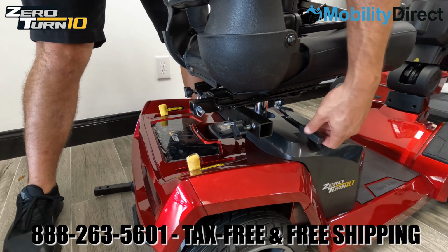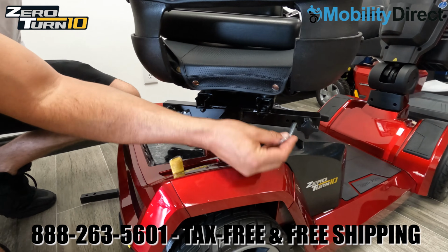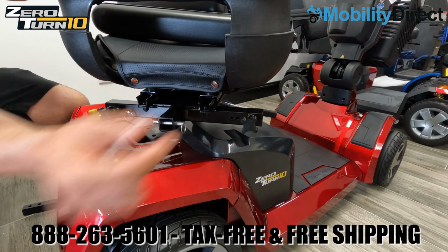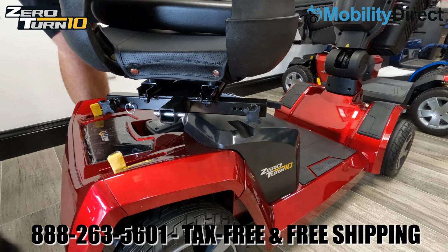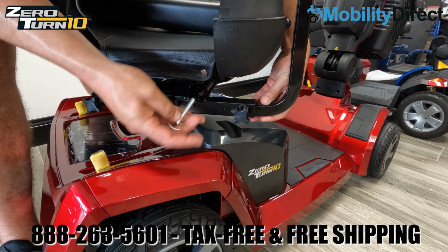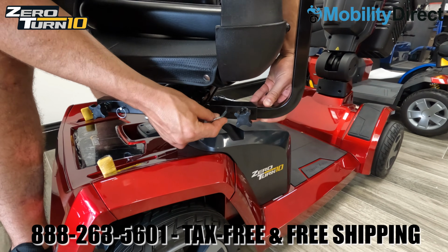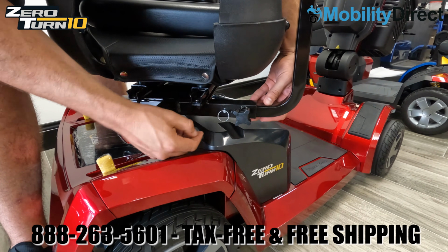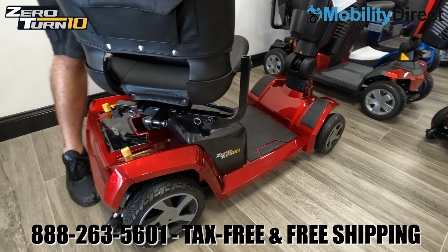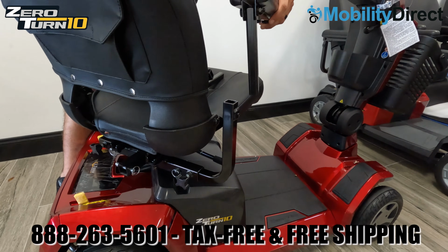Once the seat's installed, you'll want to go ahead and begin installing the armrests. The armrests work pretty easily. There are a set of 90-degree elbows. Those 90-degree elbows need to slide into the sleeves. So you'll want to start off by pulling out the pin and loosening the tension adjustment knob on one side. You can rotate the seat to make this easier, and we're doing that now to show you from a better view how those safety pins pull out and the tension adjustment knobs are going to be loosened up so that we can put the 90-degree angle into the rail.